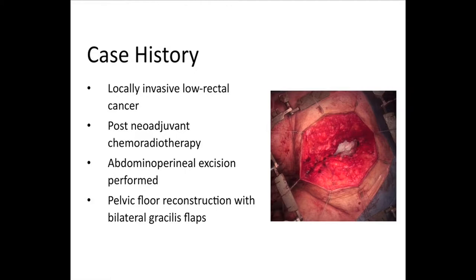The patient in this video was diagnosed with a locally invasive rectal carcinoma and had received neoadjuvant chemoradiotherapy prior to surgery. The defect seen on the right results from the abdominoperineal excision performed in the extra levator plane, the abdominal part of the procedure being performed laparoscopically. In order to restore the integrity of the pelvic floor, reconstruction was performed using the gracili muscles, which were reflected from their distal insertion into the pelvic defect.